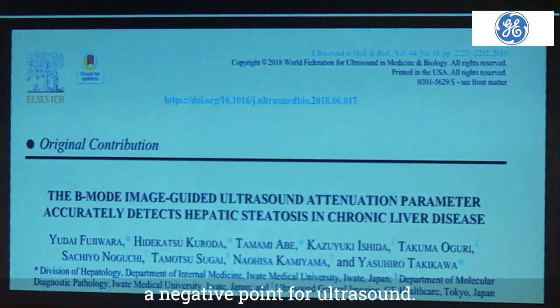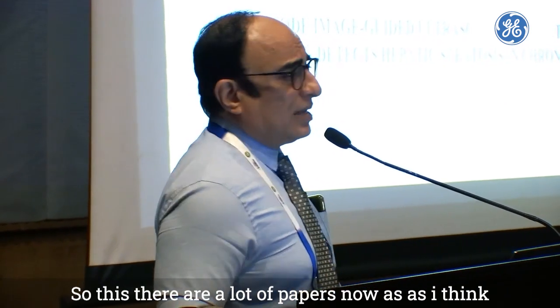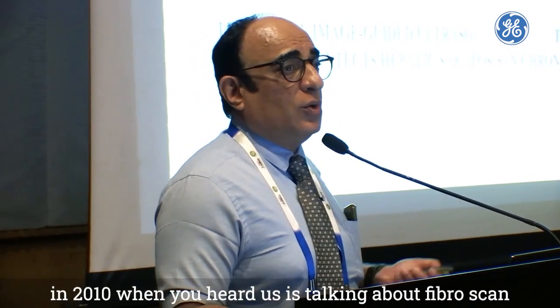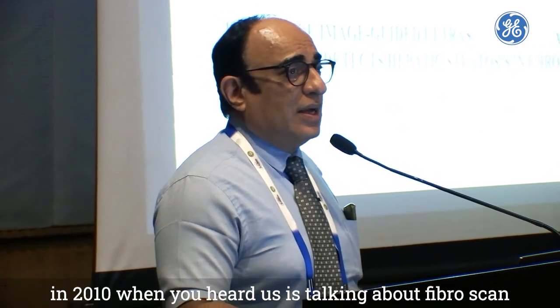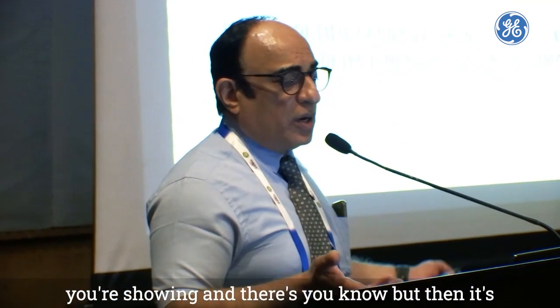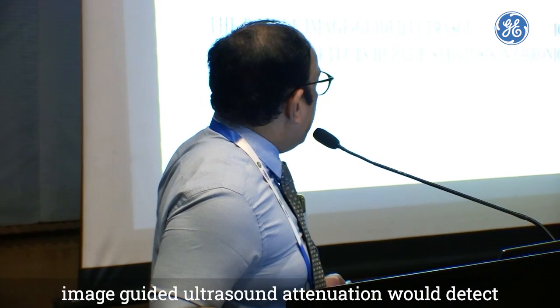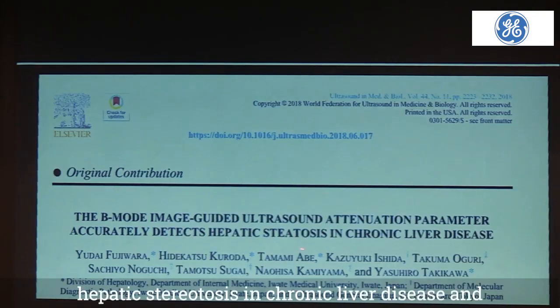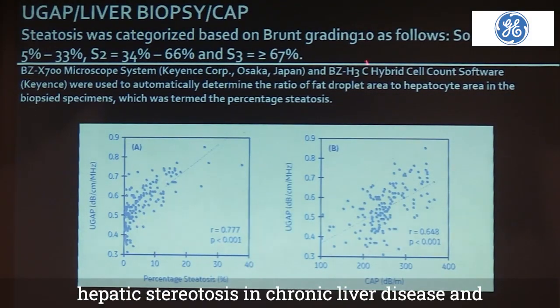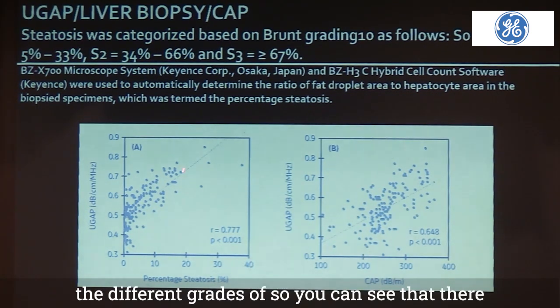for ultrasound. So there are a lot of papers now. In 2010, when you heard us talking about Fibroscan, everybody said it's a lot of rubbish, a lot of colors you're showing, but then it's data. You see, it's all published now. So B-mode image-guided ultrasound attenuation detects hepatic steatosis in chronic liver disease, and there's good sensitivity and specificity for looking at the different grades.